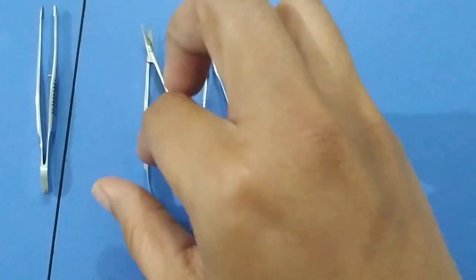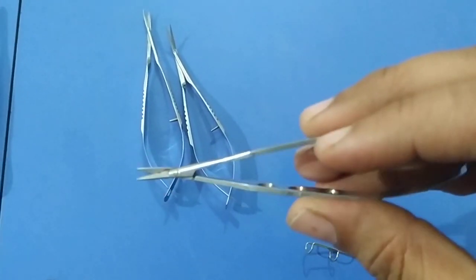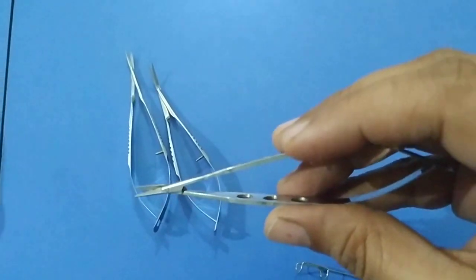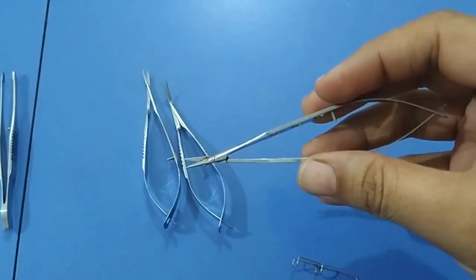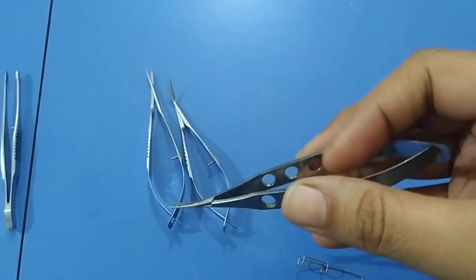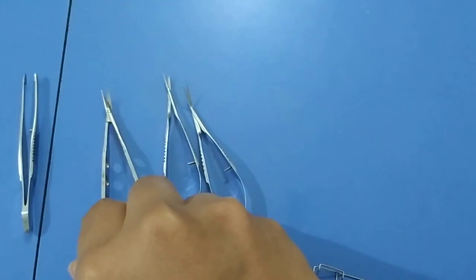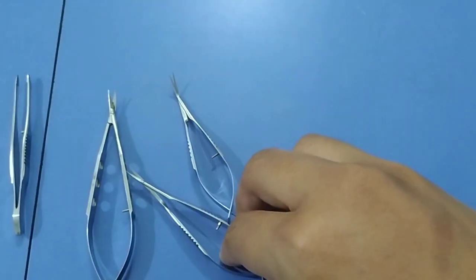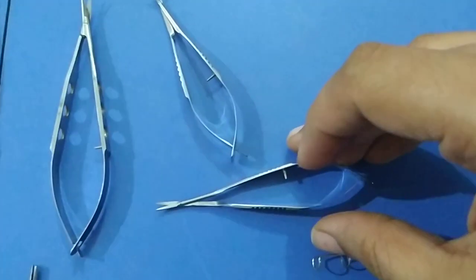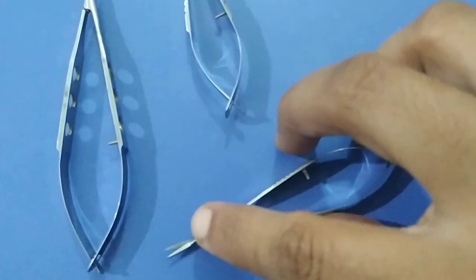Then we will move on to the scissors. This is a corneoscleral section enlarging scissors. It is used to cut the conjunctiva and Tenon's capsule during extracapsular cataract surgery, to cut the corneoscleral flap as a section enlargement in extracapsular cataract surgery, and to cut the corneal button during penetrating keratoplasty. This is a Vannas scleral scissors — it is a little bit smaller in size and the blades are also shorter.